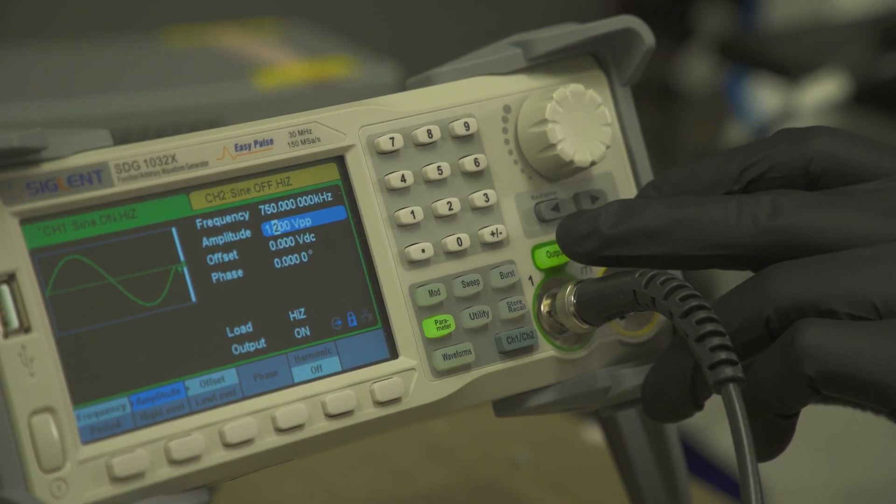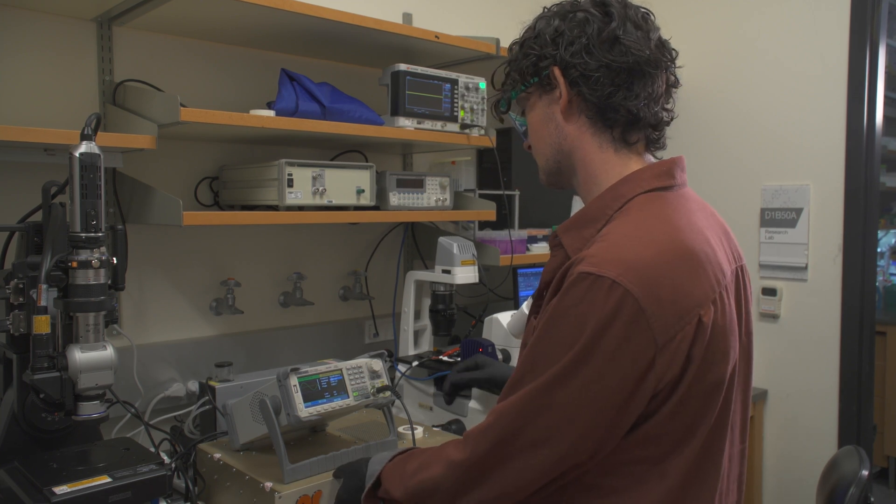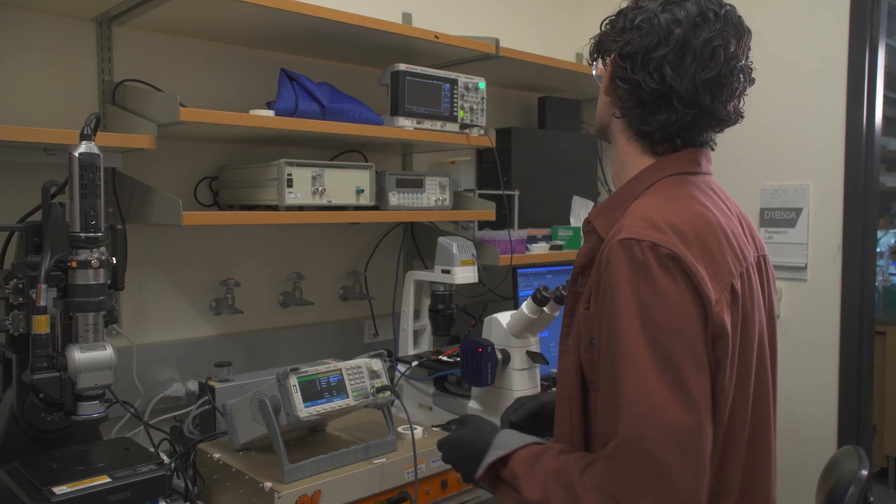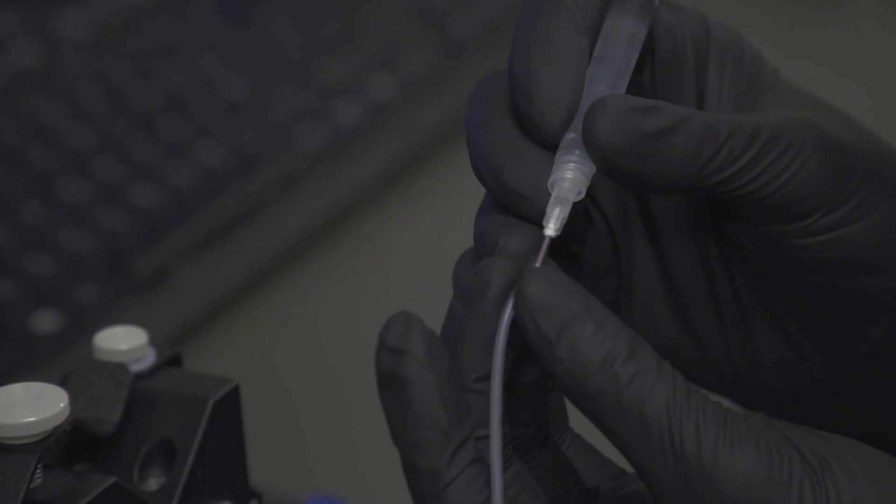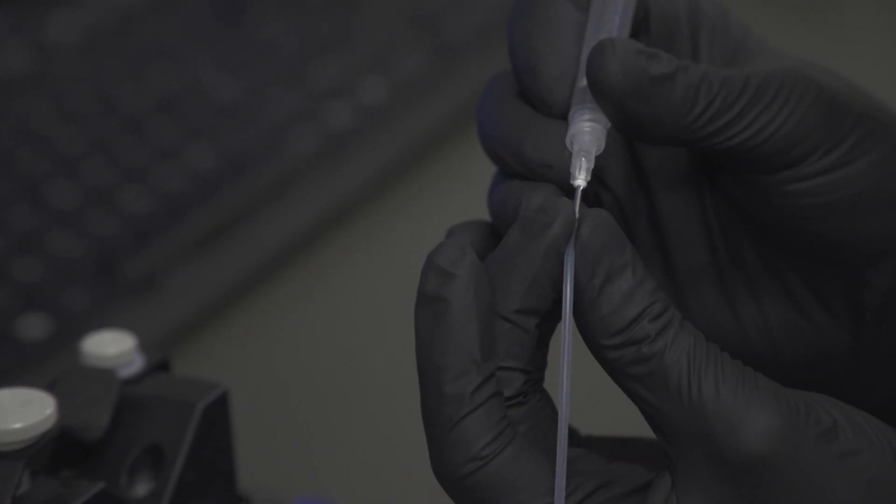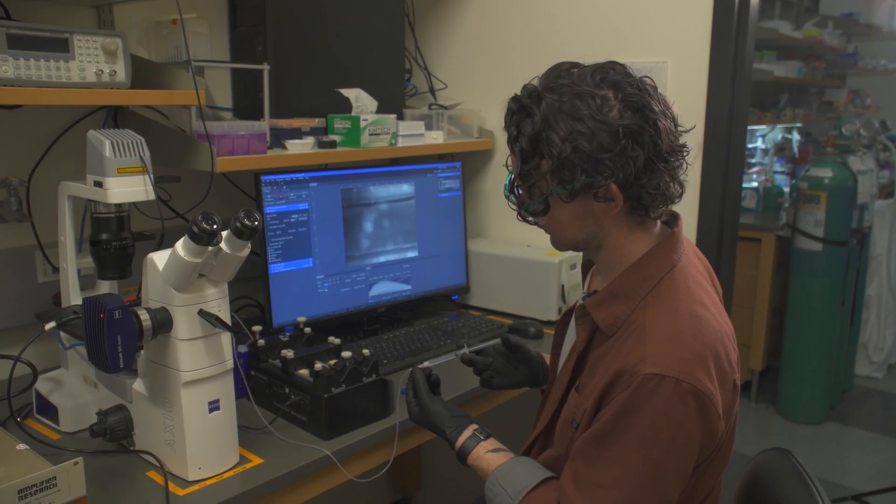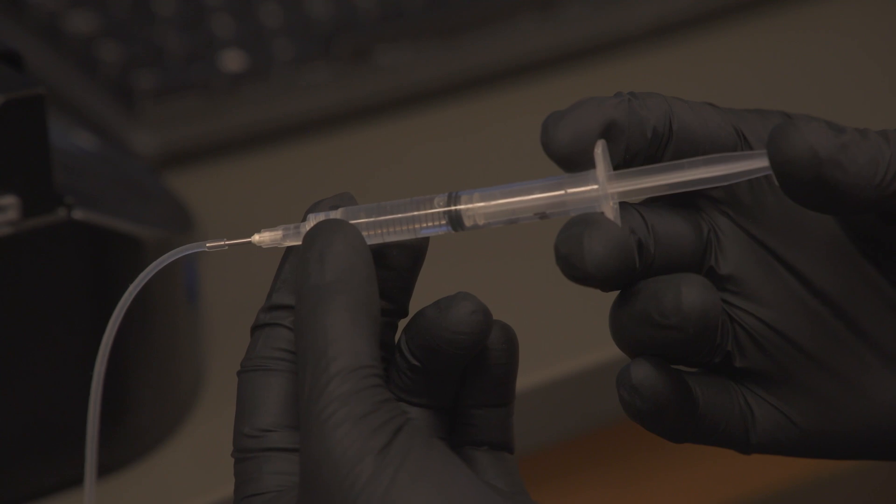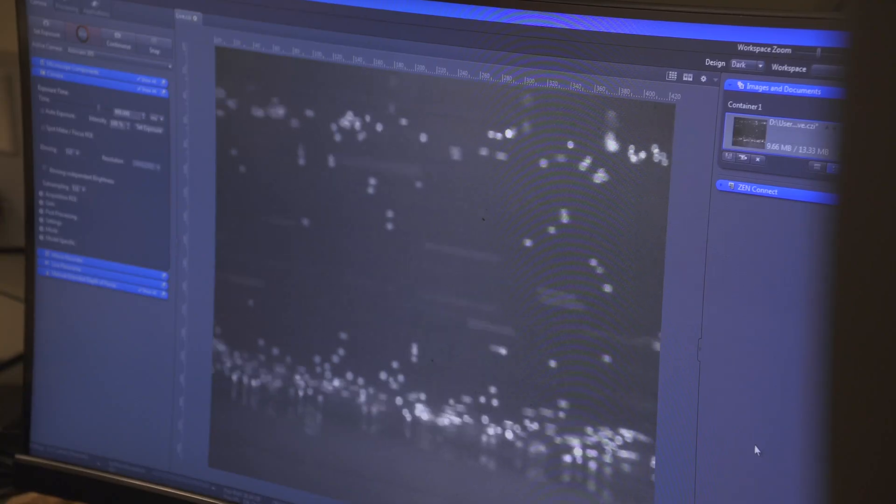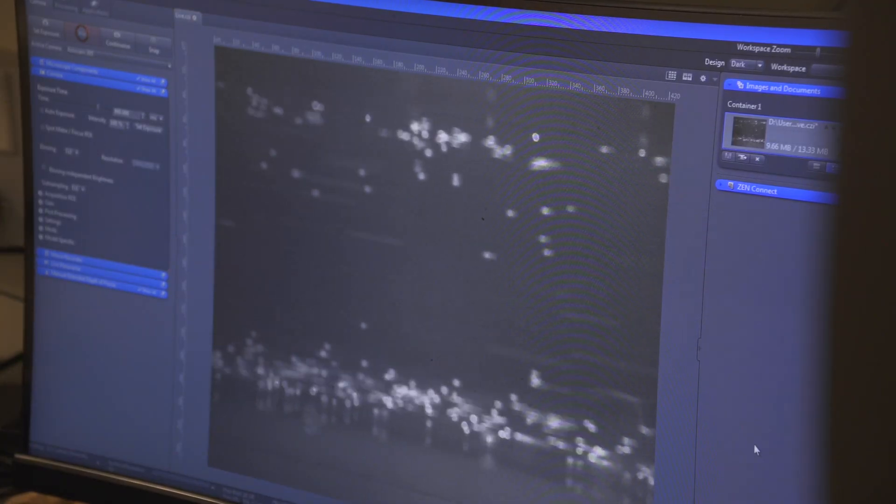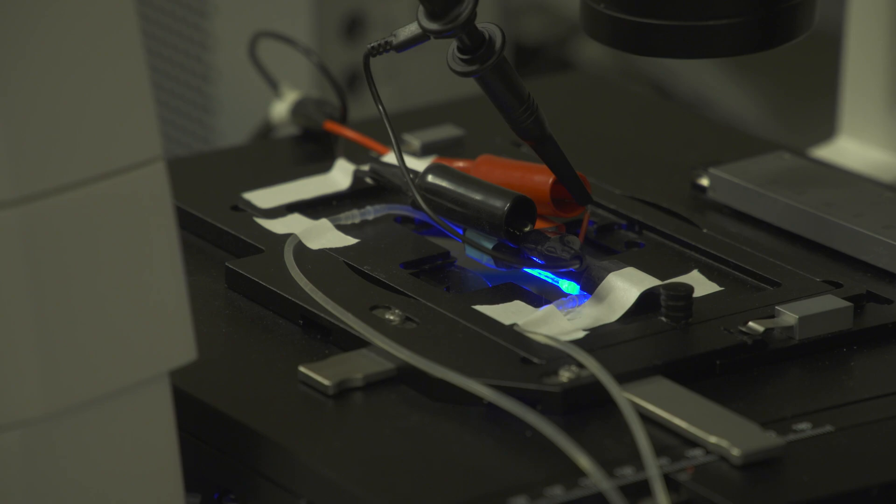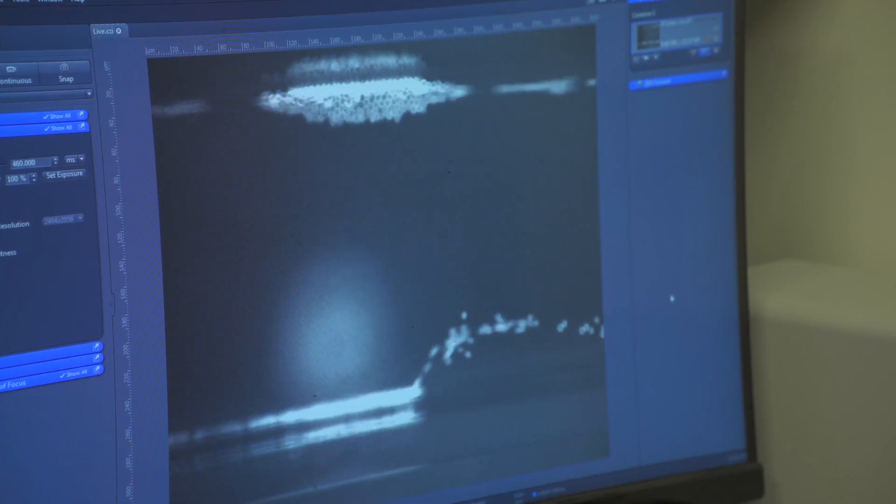Here we're using sound waves to manipulate particles to isolate them from blood samples. These sound waves that we're using in this device help to push those particles to the walls of what's known as a trapping channel. Those particles are trapped along the walls, but all of these excess blood components can just be ejected out of that channel.